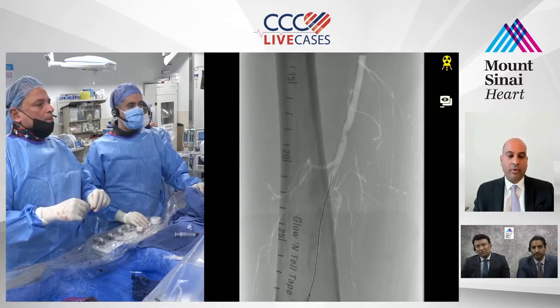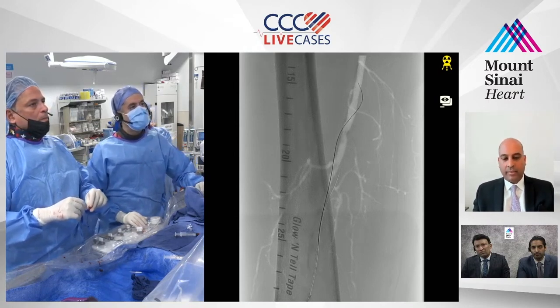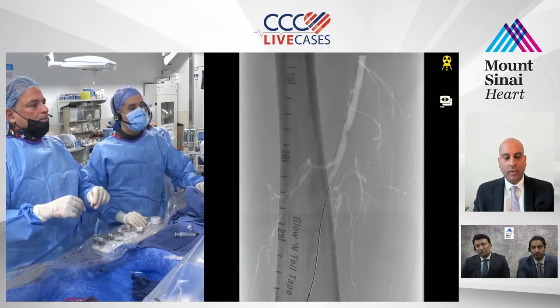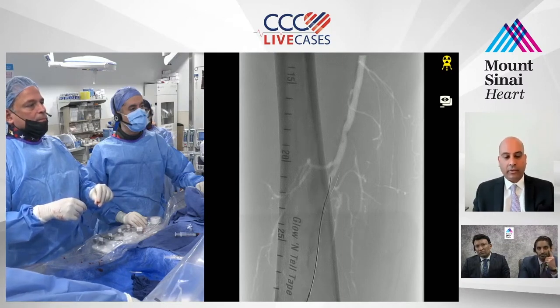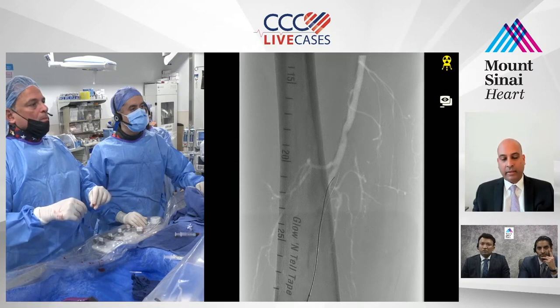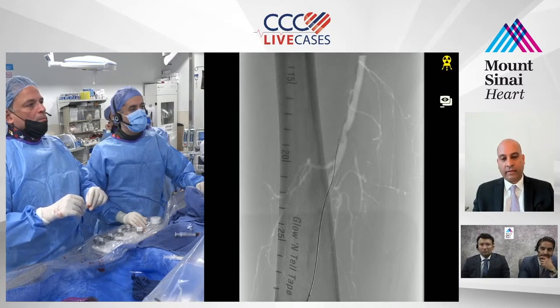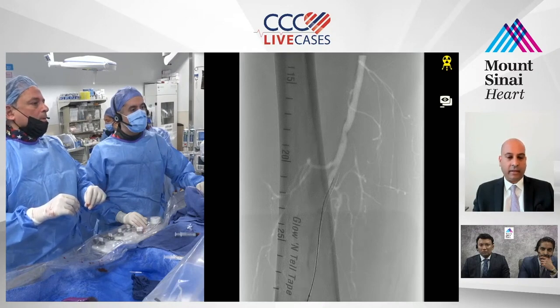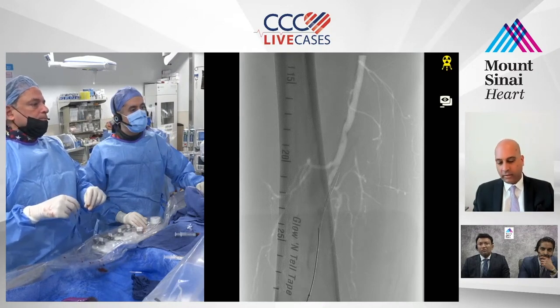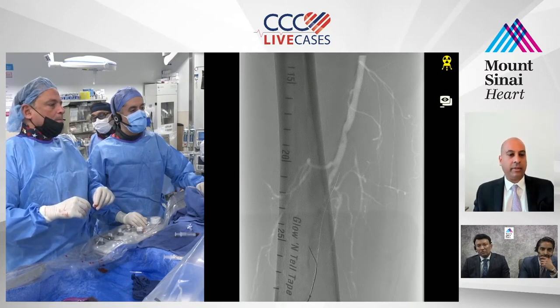In that case, I would have accessed this anterior tibial, put a sheath in, run the drip, whether it's a combination of heparin, verapamil, whatever your cocktail is, and then fix it like what PK and you guys are doing right now. The only other possibility here, although not ideal, is an antegrade proximal SFA stick, fix the SFA, fix the pop, see what the outflow tibial looks like. Well, you don't want to fix it because it's not a CLI patient. Leave it alone if you've got inline flow, and then come back a different day to tackle the CFA. That's another possibility. It's not ideal, but it's another possibility.